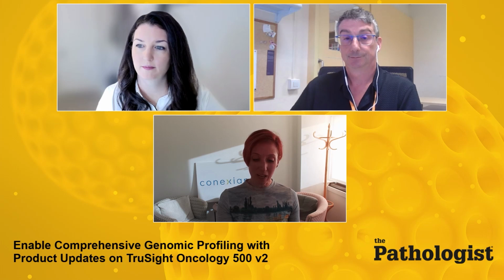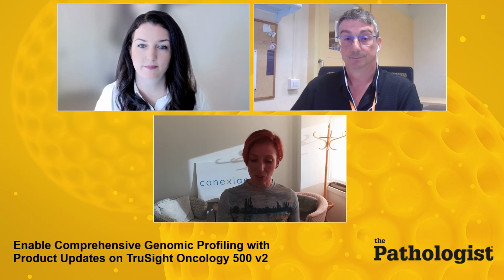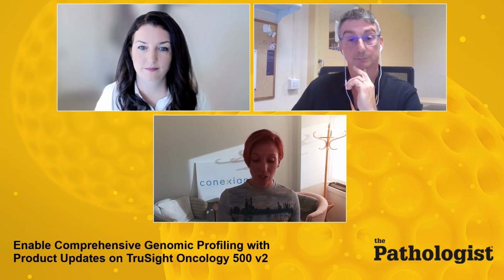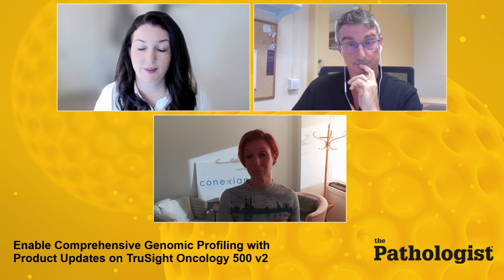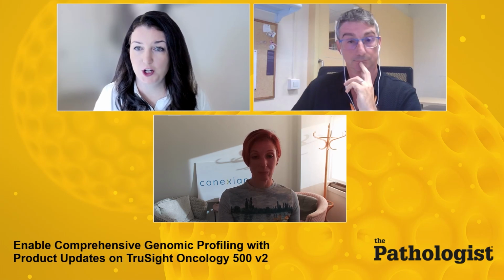Heather, has there been any consideration for updating the gene list or biomarker coverage in TruSight Oncology 500 to align with the latest clinical databases, such as COSMIC or ClinVar? Yes, so the V2 product today has the same gene panel as the V1 product.